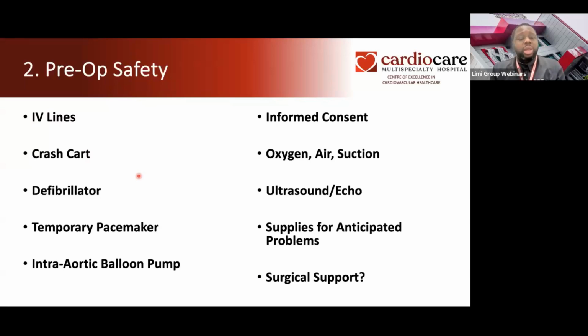You must have a functional defibrillator, and not an automatic one. You need a manual one. And I'll tell you the reason why. Because you don't have time for the machine to be analyzing. You need to be able to deliver a shock as soon as it is needed.